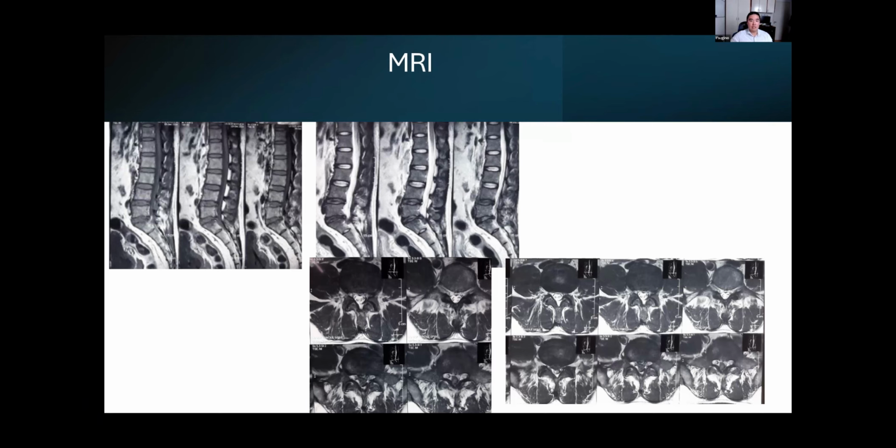I wouldn't delay my surgery because of a technique, because a disposable is not available or something like this. In cauda equina syndrome, and I'm saying that because we have a lot of fellows here, we should do what we are most comfortable with and what we have in hand, what the available options are. So this is just one point I would like to address here. This is a very different case from a simple disc herniation.